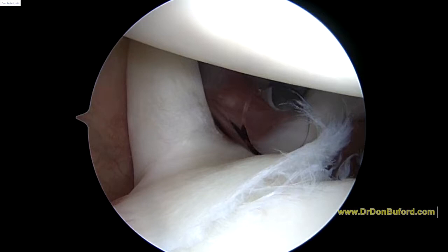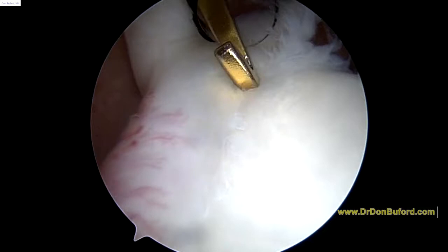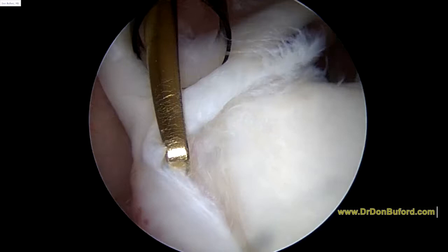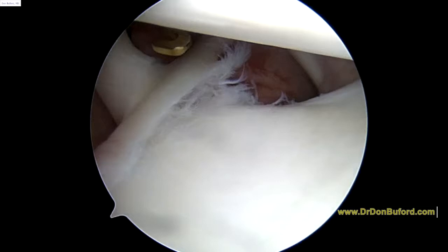You have what we call a type 2 SLAP lesion, which is where this is detached. You can see that it's torn. The issue here is going to be bringing up the cartilage so that we can get this to heal back to the bone. That's an injury that we're going to have to fix for you, and that's something we expected. As you externally rotate your arm, you can see how that's unstable.